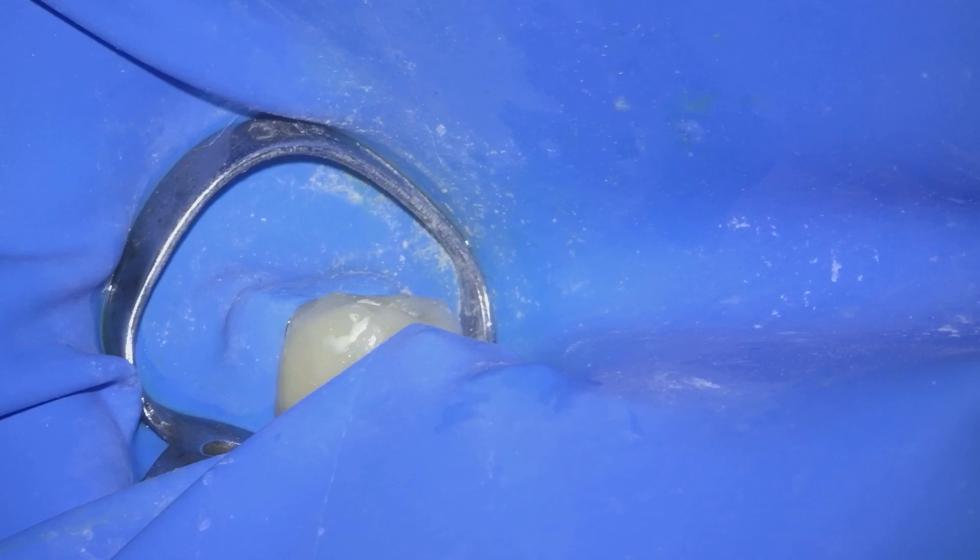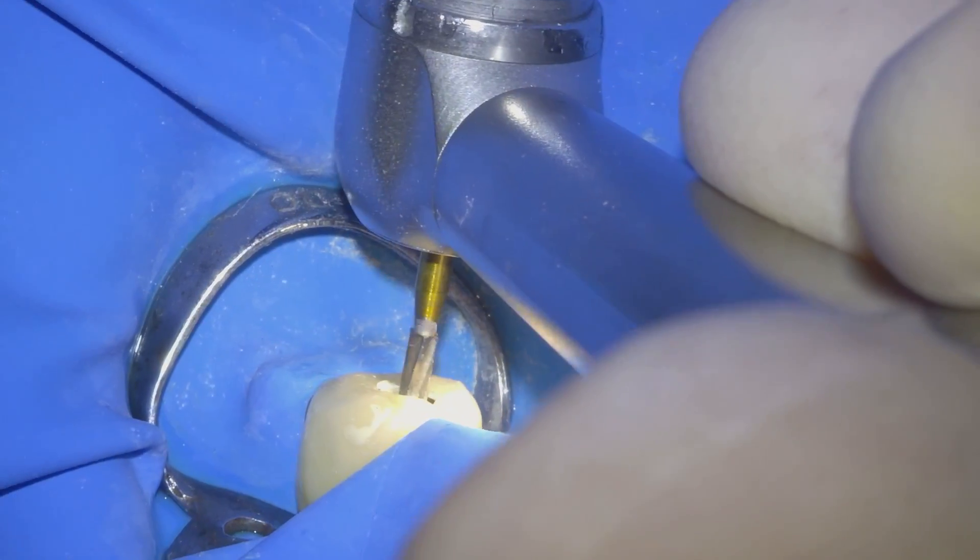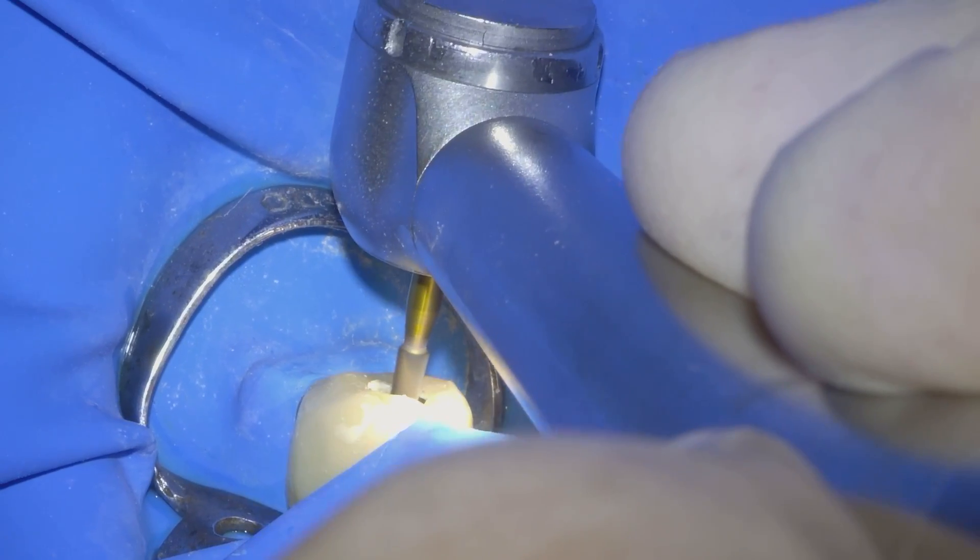To clean the pulp chamber I always use burrs with inactive tips such as Endo-Z burrs, along with a lot of alcohol to remove any remaining cement.